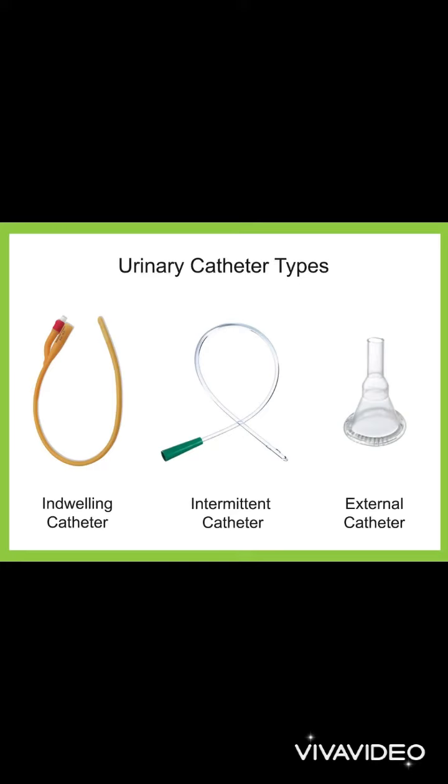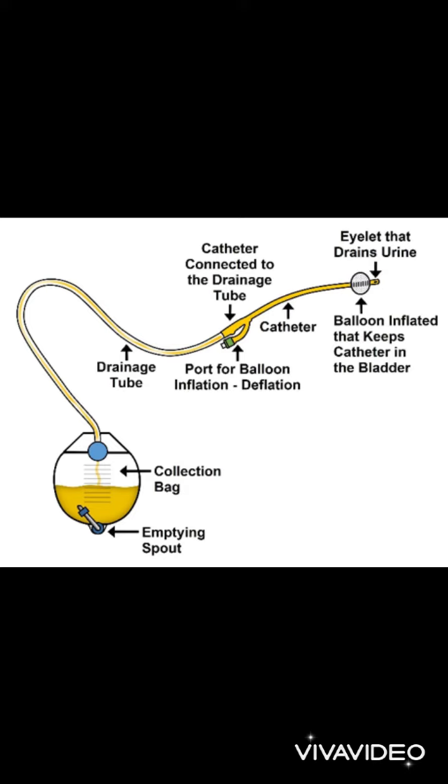And here you can see how those catheters look. There's the indwelling catheter, the intermittent or short-term catheter, and the external catheter. So now I'm going to be talking about urinary output measurement.